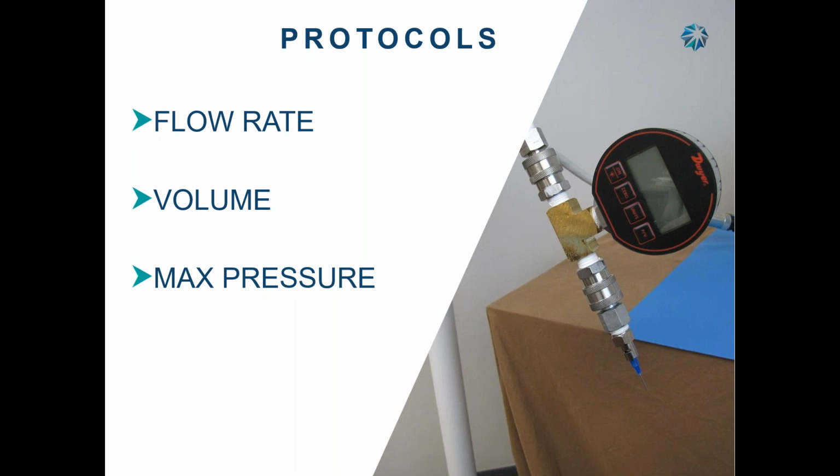Also, when you have that flow rate, Stellant and MRI injectors only go up to 10 milliliters per second. But cath lab interventional injectors like the CVI, the Angiomat, Mark 5 Provis, Mark 7, go up to 50 milliliters per second.